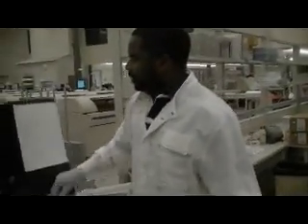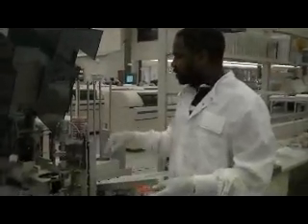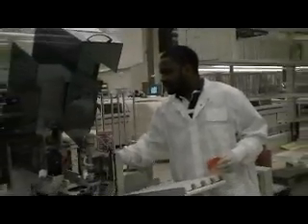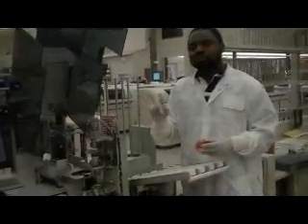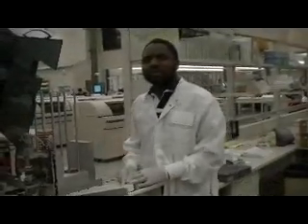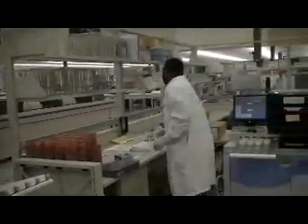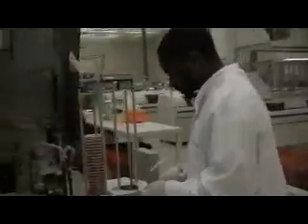Now, what this machine does is it takes a urine sample, then it dips a loop into the urine and streaks onto this plate. There's a lot of motion on the machine and a lot of sensors there. So on your PM, you need to clean your sensors first. For cleaning sensors, just use a damp wipe.